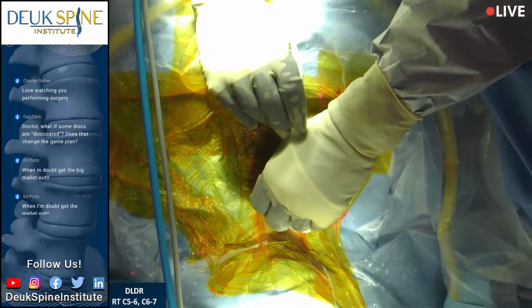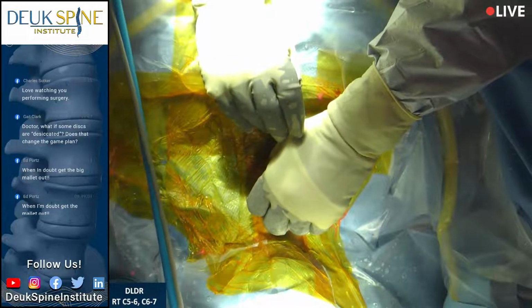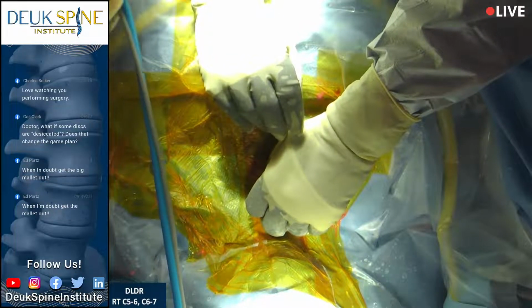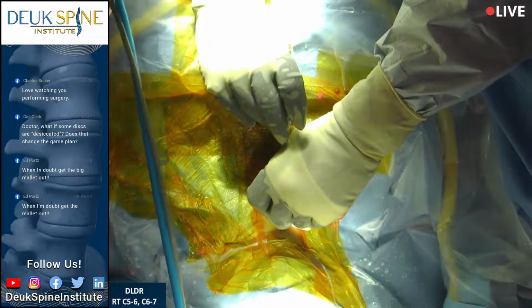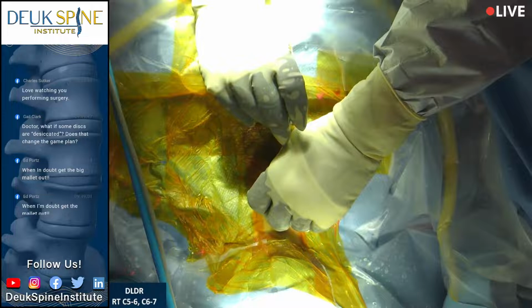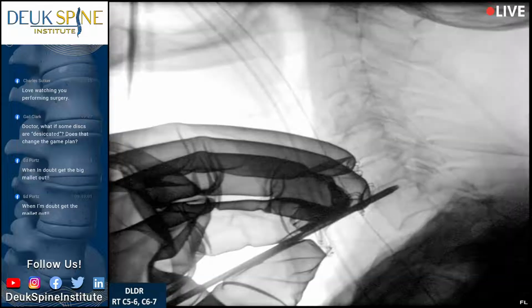Flynn is here today running the machine. All right, are we ready? So we're going to move from 6-7 up to 5-6. Everyone agree? Agree, sir. 2, 3, 4, 5, 6. All right, here we go. Shot. We're good, we're good. That's it? All right, shot.